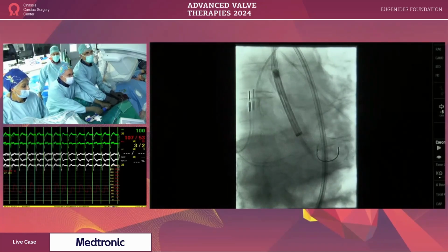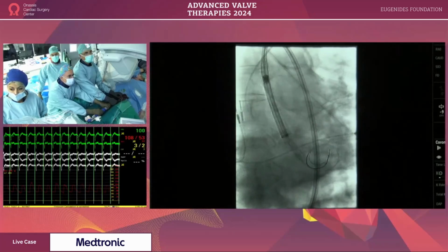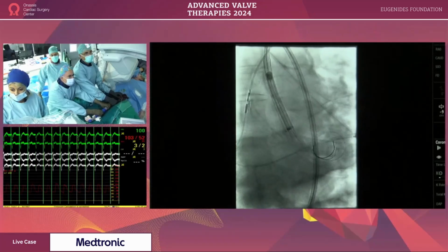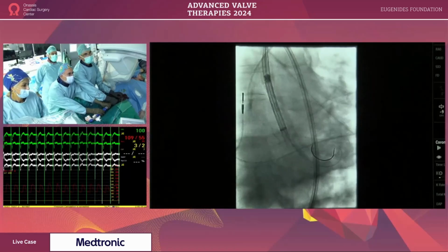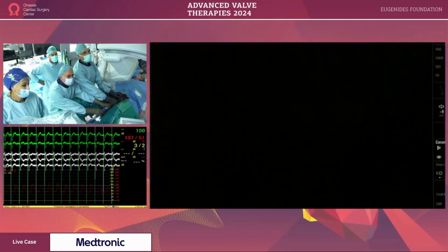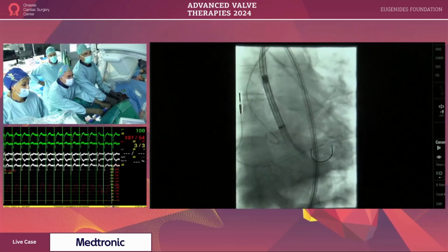Okay, let's go. You've got to use some dye over there and see it. We can't see. Yes, we will. Again up. It's very high again. Yeah, we'll see. Yeah, I think it's go ahead right there, very fast. Not bad, but you have to pace faster.